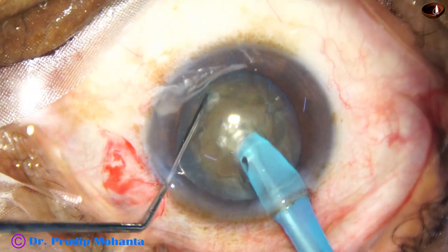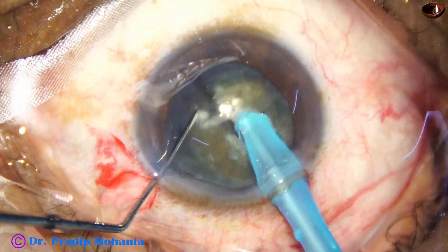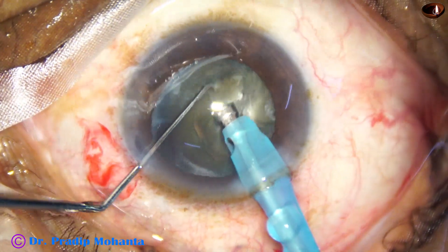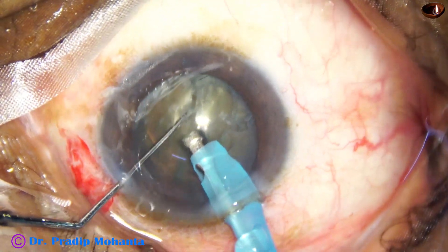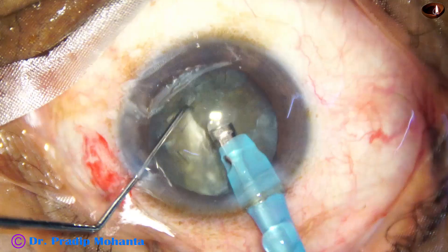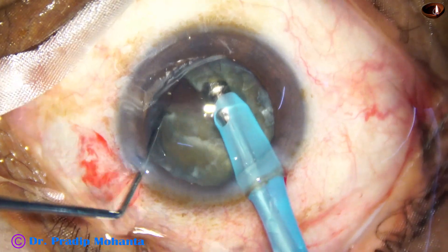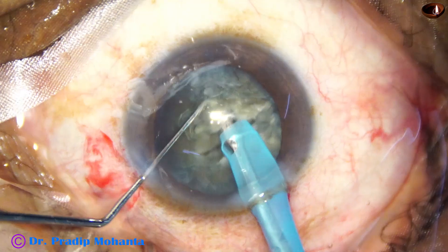The needle goes near the opposite equator — it has a long course. As it reaches near the opposite equator, the chopper is used to get a nice crack. Now I rotate the nucleus — in this case I rotated only 90 degrees, then anti-clockwise, and rotated 180 degrees — sculpting on one part and separating the two hemi-nuclei completely.